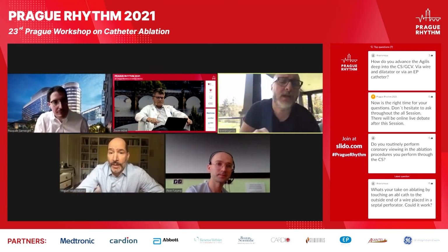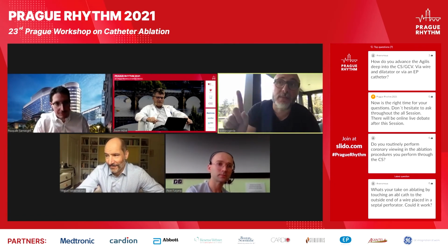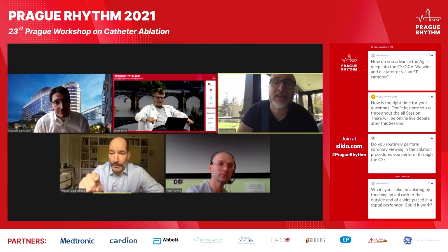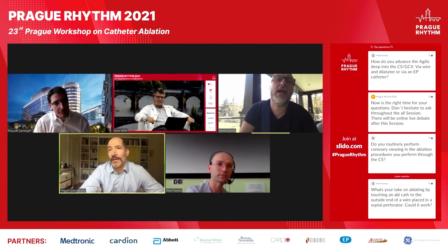But you have made your judgment. You include just ablation from the endo, one lesion. I'm not saying multiple targets. One burn opposite to the earliest site. You keep saying multiple targets. I'm saying one site opposite to the earliest site. I saw your case, how you did that, and then you went to the AIV. No, the last case. That's because that's a true epicardial. I'm talking about my third case, only from the endo. Okay. No, that's not right. You didn't see then my last case.